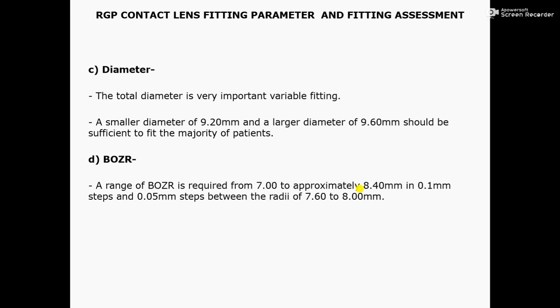Interpalpebral fits are often rather uncomfortable due to the interaction of lens edge and lid margins.